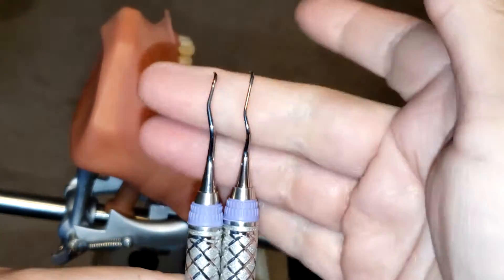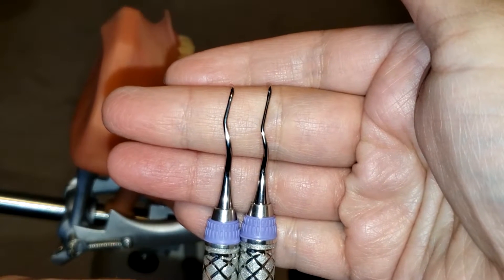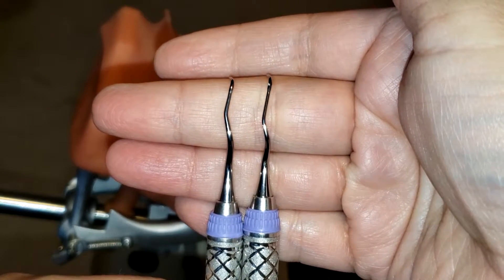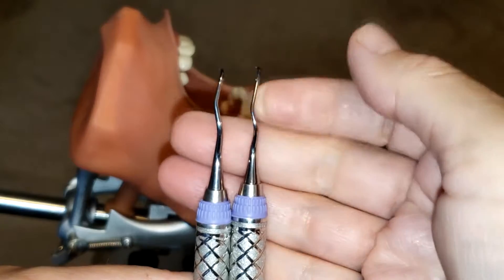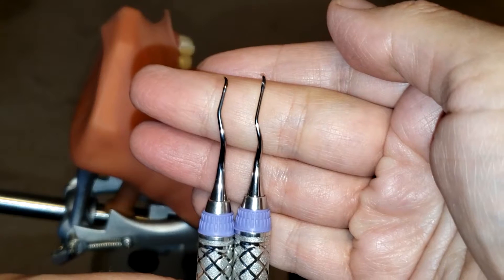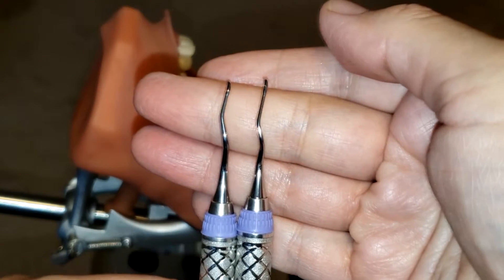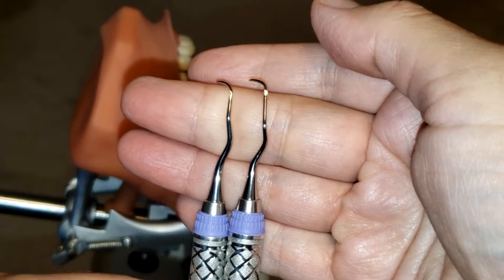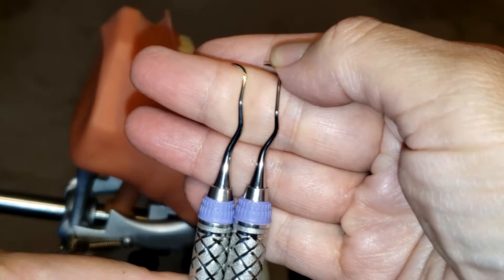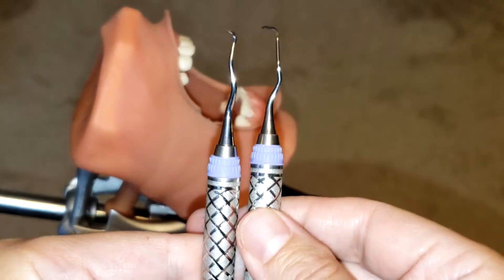...is your regular Gracey 11/12 curette. You'll see that the lower shank is actually a little bit longer than the regular Gracey 11/12 curette. Because it has a longer lower shank, it can go and reach into those deep, hard-to-reach pockets. It is an excellent periodontal instrument used subgingivally for periodontal pockets, for moderate to heavy calculus removal.